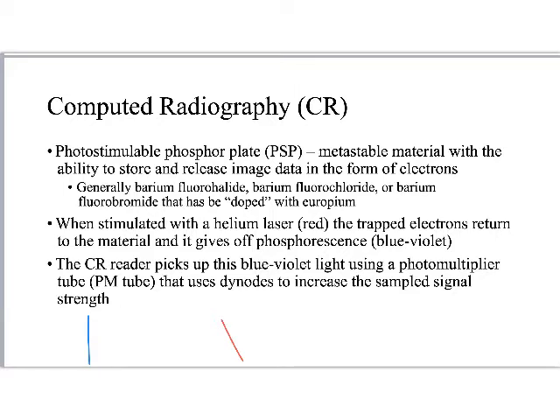And so if we were increasing energies from one side to the other, we would have all the various colors of the rainbow between these two. And so that's helpful because there's basically a gap. I'm not going to be accidentally sampling the laser over here when I'm trying to just sample the photostimulable phosphorescence being given off by the PSP over there. So that's why that is. I don't want to get too far into the weeds with that, but I think it's interesting.